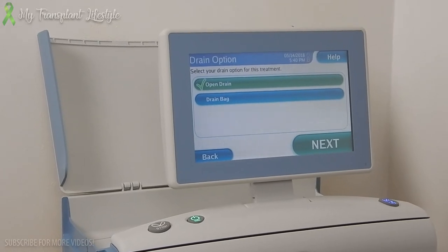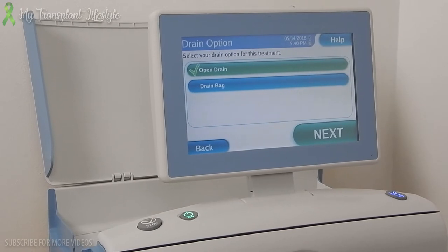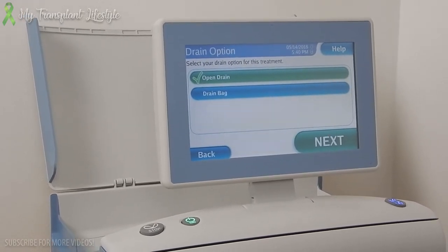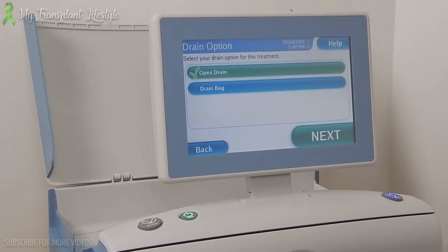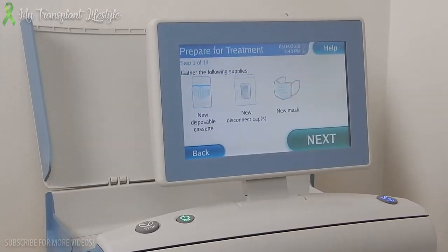Select a drain option, then touch next. You have the option to either do an open drain, which would lead to your bathroom, or you can have a drain bag. For us, we always go with an open drain.